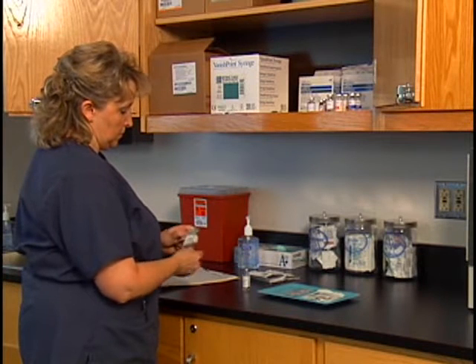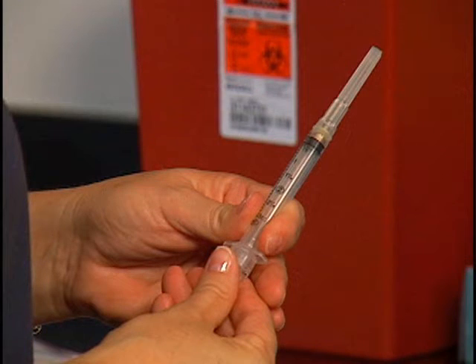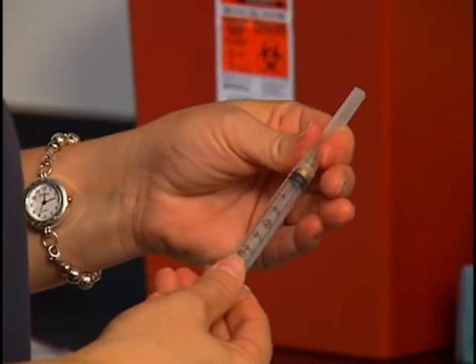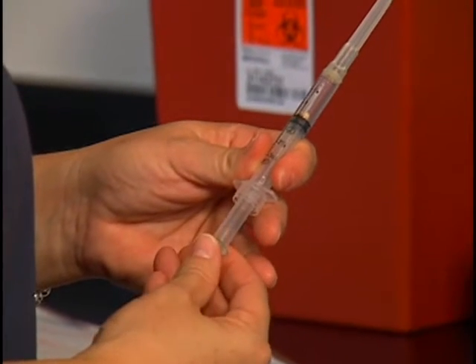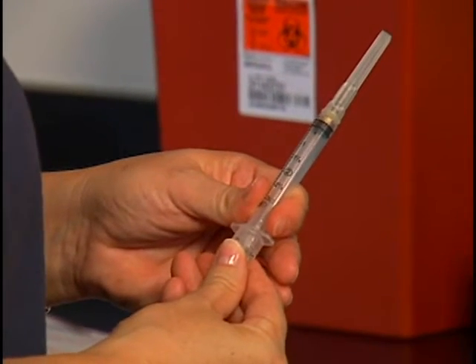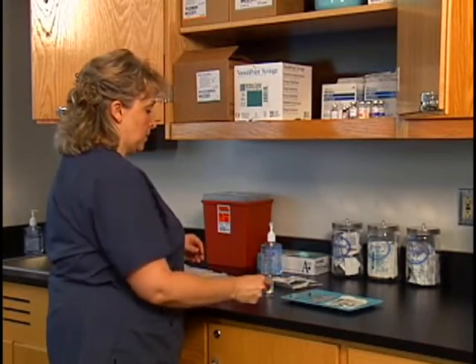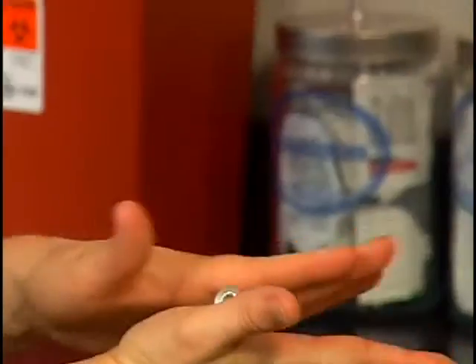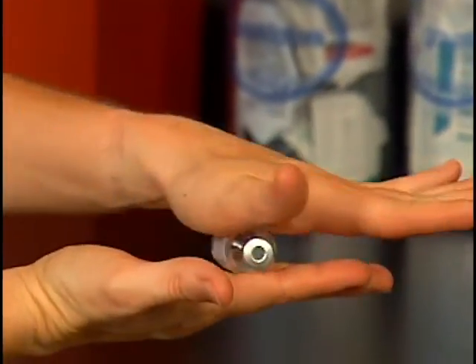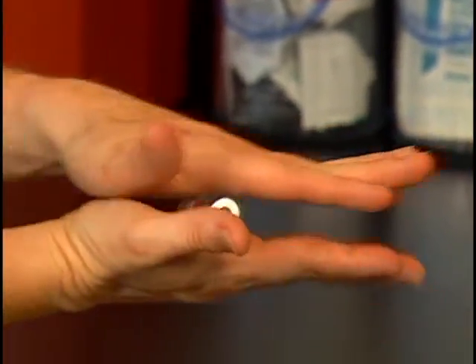Open the syringe and needle package. Check to ensure that the needle is attached firmly to the syringe. Do this by grasping the needle at the hub and tightening it. Break the seal on the syringe by moving the plunger back and forth several times. Check the drug label a second time to ensure it is the correct medication. If the medication requires mixing, roll the vial between your hands to obtain a uniform suspension of the medication.